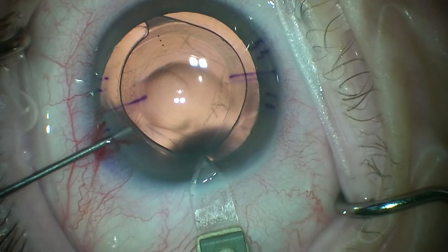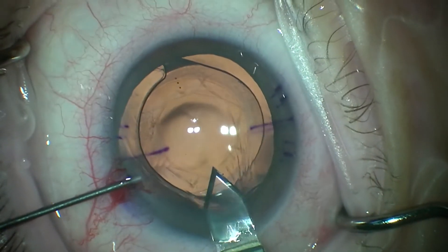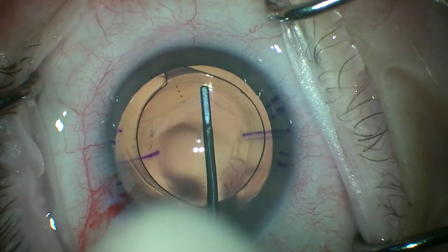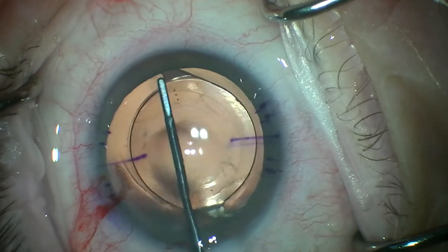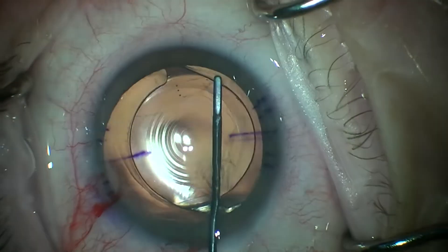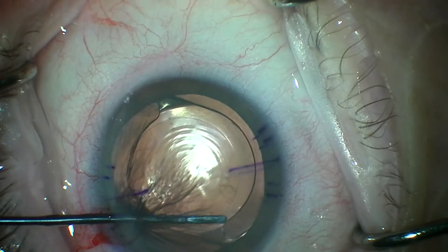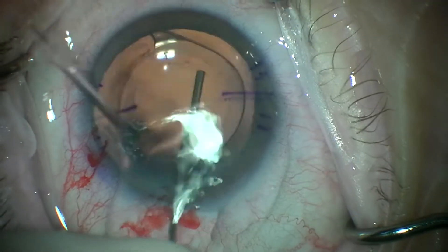We've done some lidocaine and some viscote. If you look closely, you'll see the edge of the YAG capsulotomy. This is a Grover-Fellman spatula — invented for ab internum trabeculotomies — that I use to go underneath the edge of the anterior lens capsule. We'll work our way around a little bit and then place initially some viscote underneath the edge of the capsule.